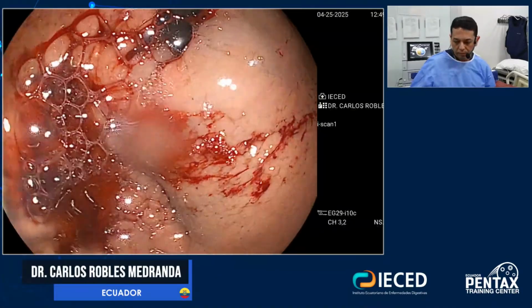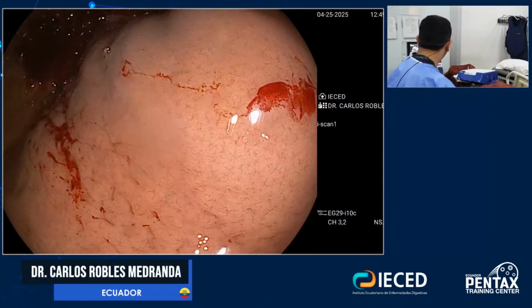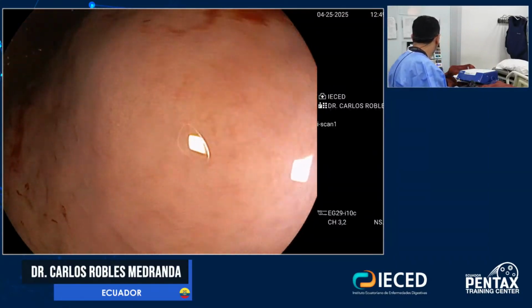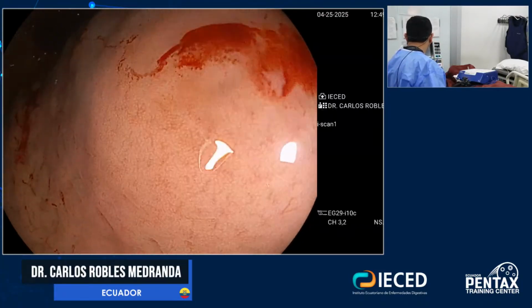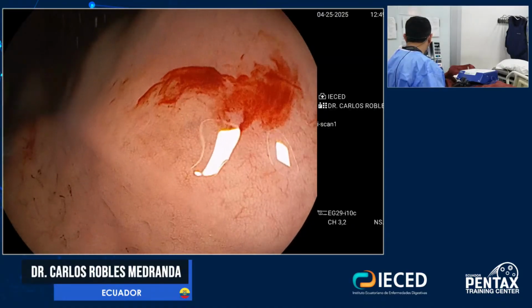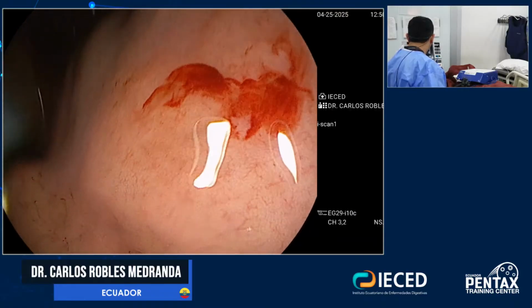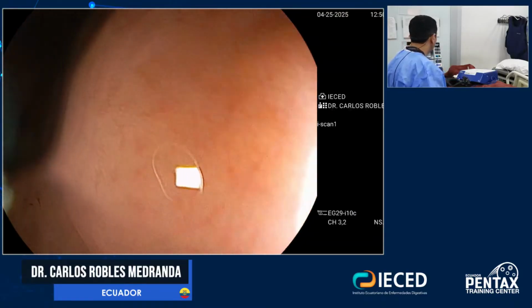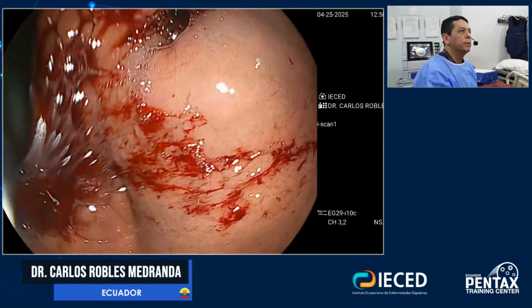So now, okay, and now we will use the argon plasma.